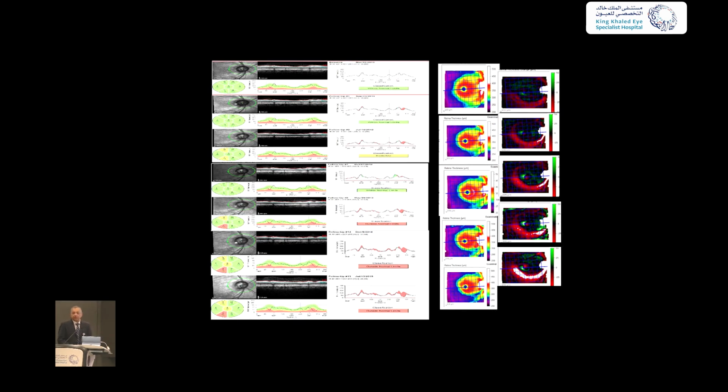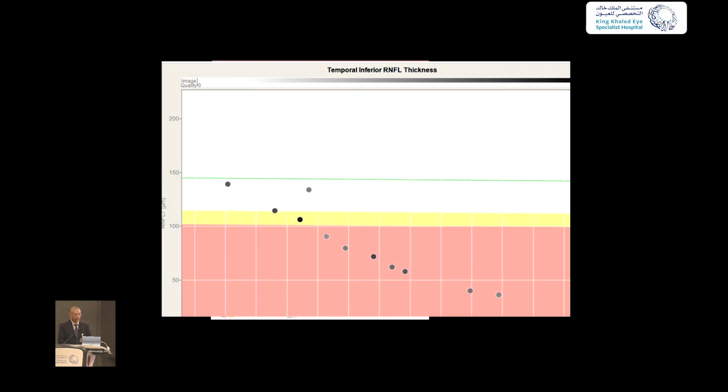There is a patient who continues to progress despite everything that I do, and this is glaucoma. As you very well know, I saw in the clinics yesterday very advanced cases and very tough cases. And you can see how this patient has been progressing over time with the losses of the nerve fiber layer and macular thickness. You can see it on the progression graph. But what's the anomaly here?